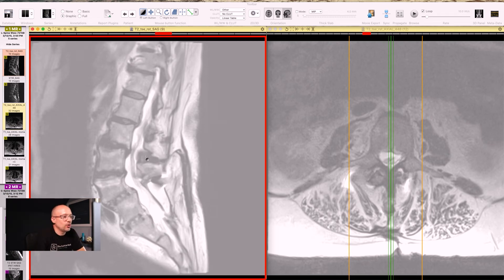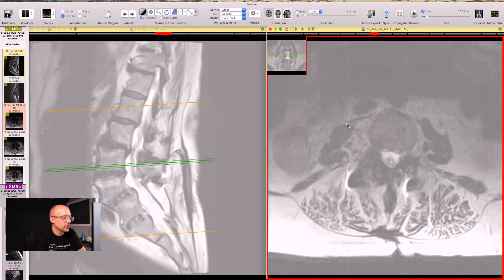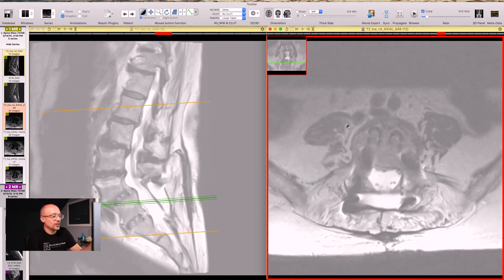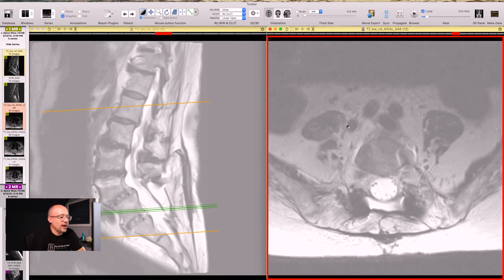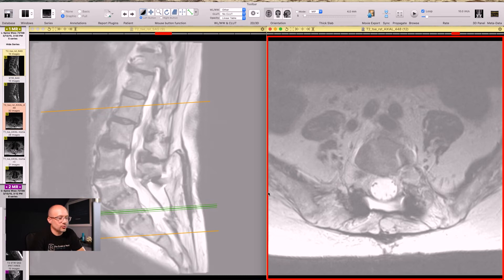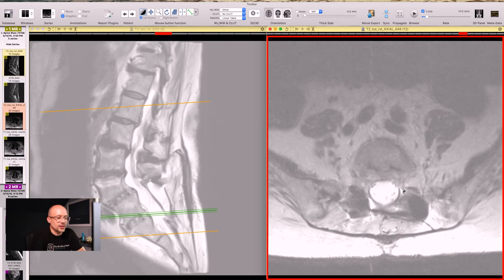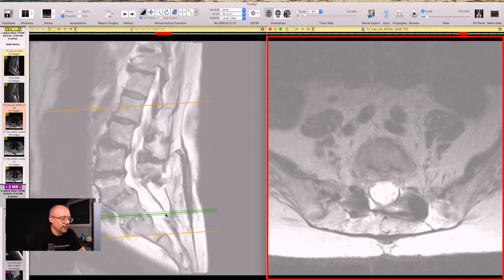Now let's go over to the right-hand side of the screen or those axial views. You can see on the left-hand side, it's going down, right? So it tells us where we are. Right now, I'm right at that L5 S1. You can see right there between L5 and S1, kind of in that disc space. And what do we have? Well, this is the spinal canal. So what I'm circling right here is nice and big, open, and wide. That, what we're looking at, is the space right here that I'm outlining on now the left-hand side. So that is where we are at.